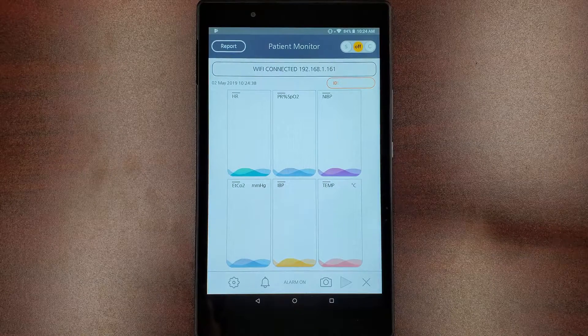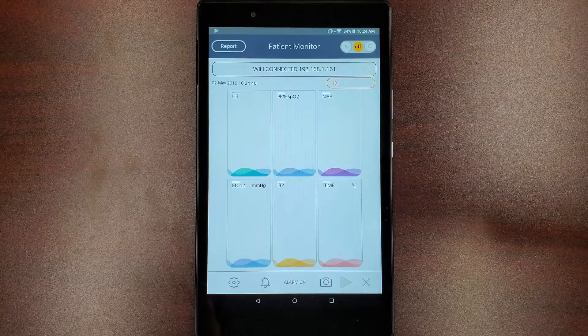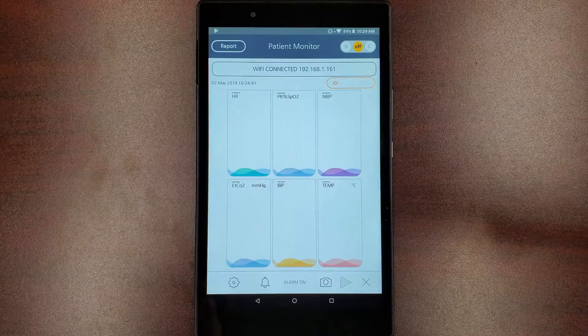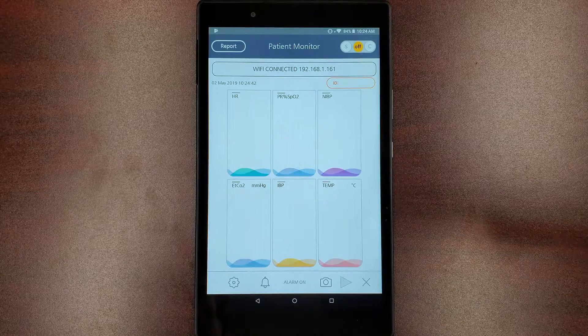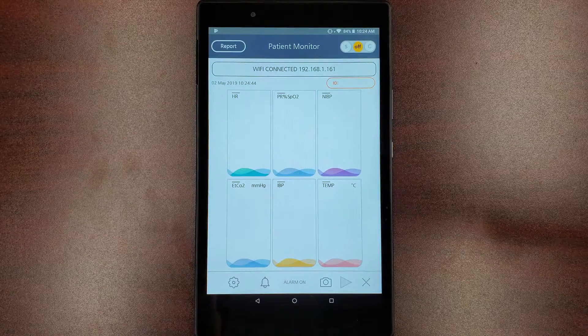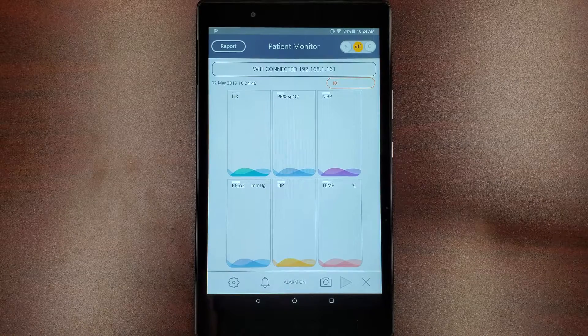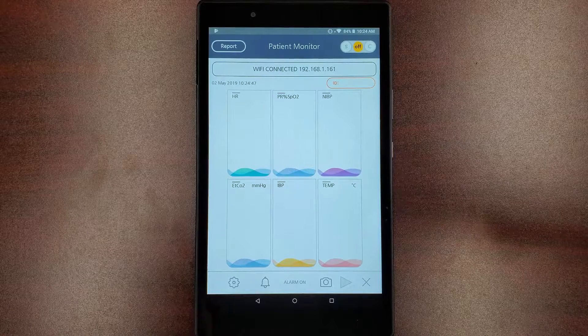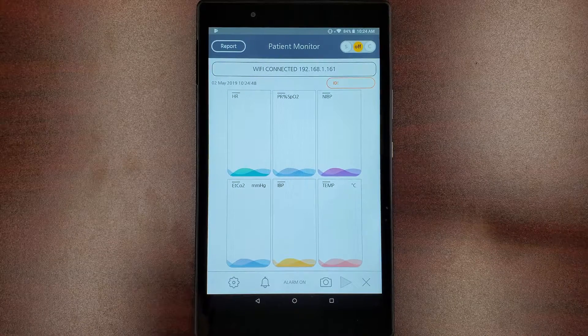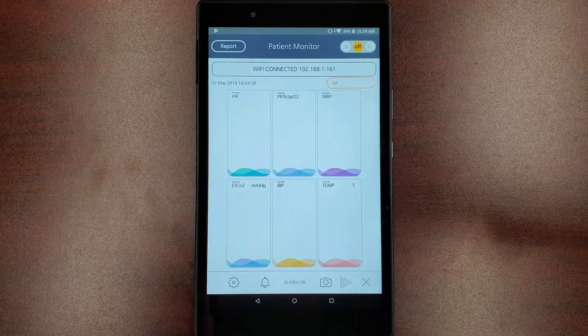Let's begin with server mode. Server mode is best used when there is only one device that will receive the data from your patient monitor. This mode sets up a direct link between your patient monitor and the mobile application.